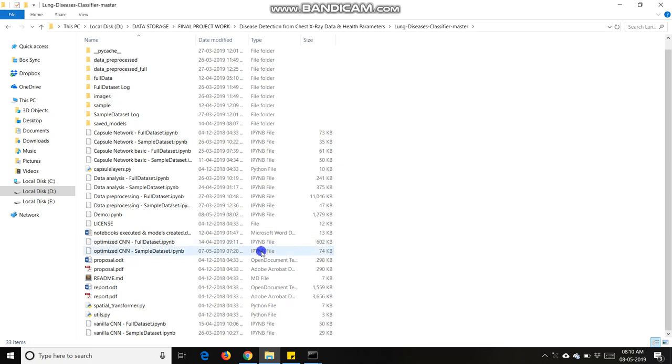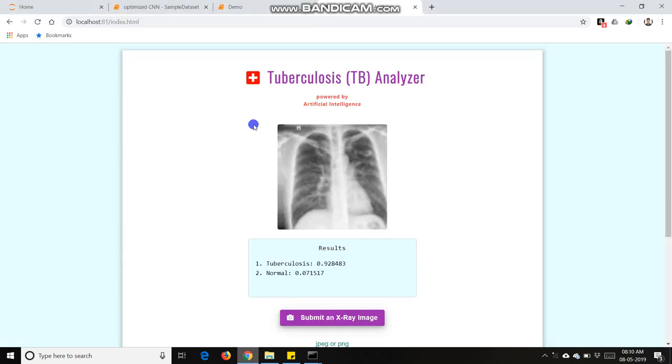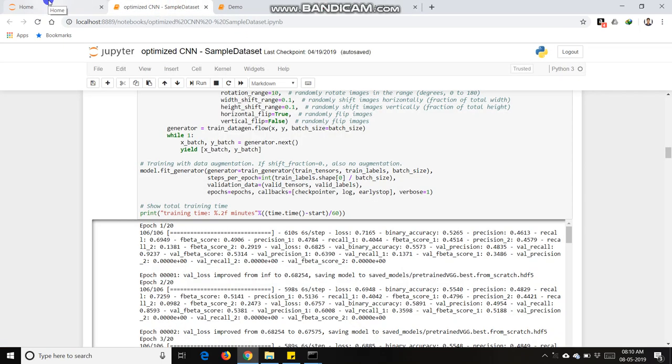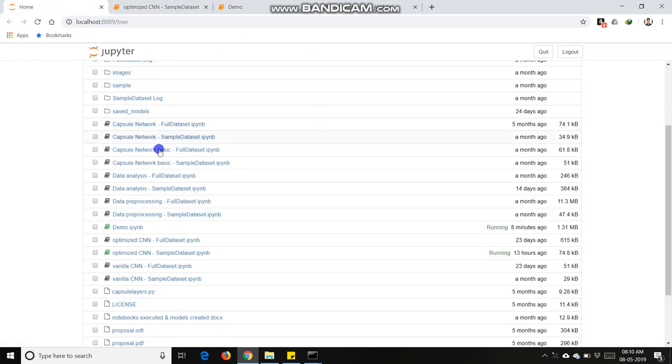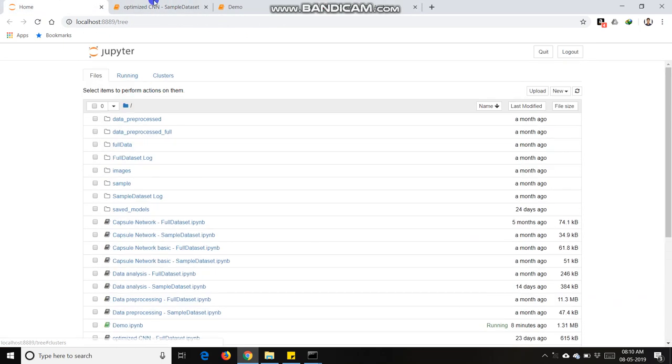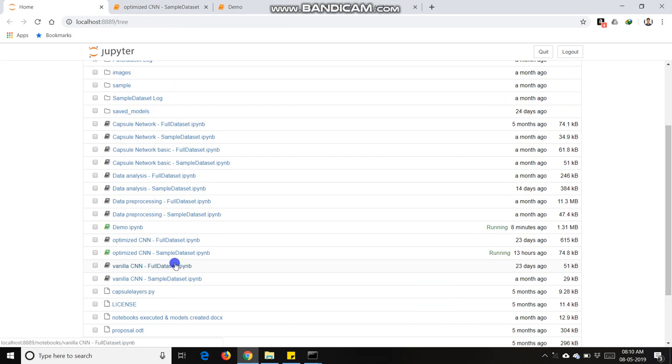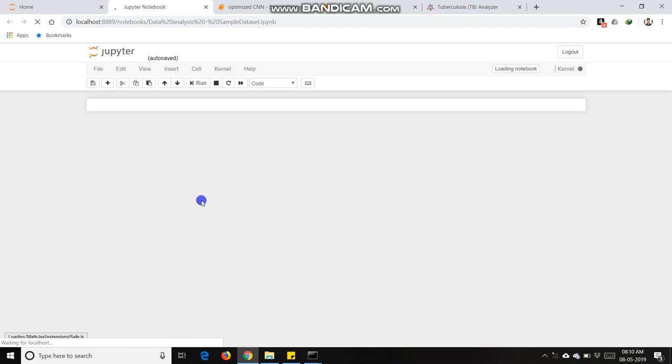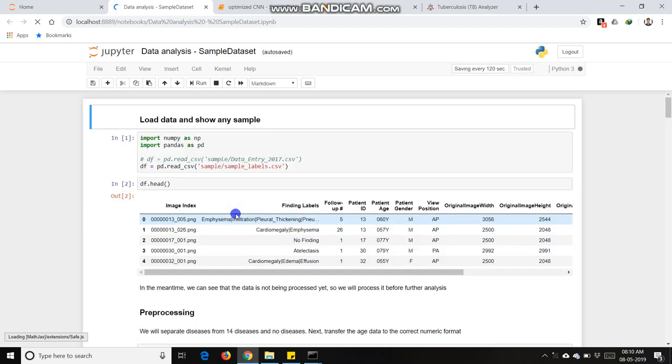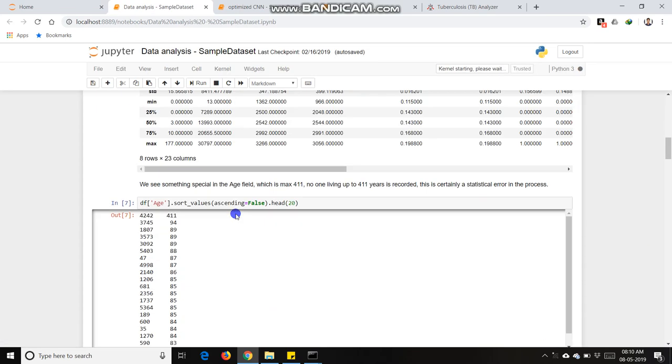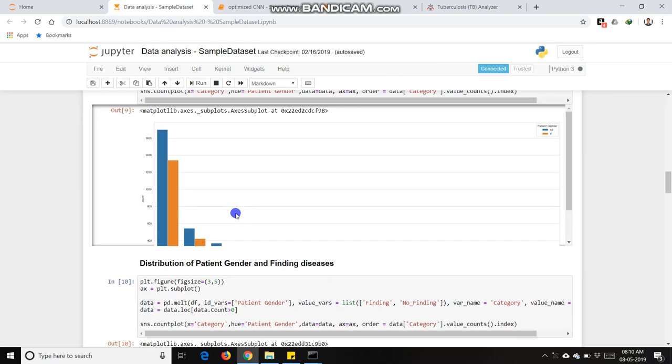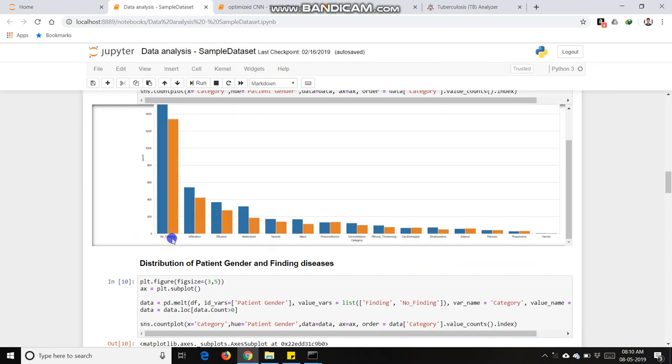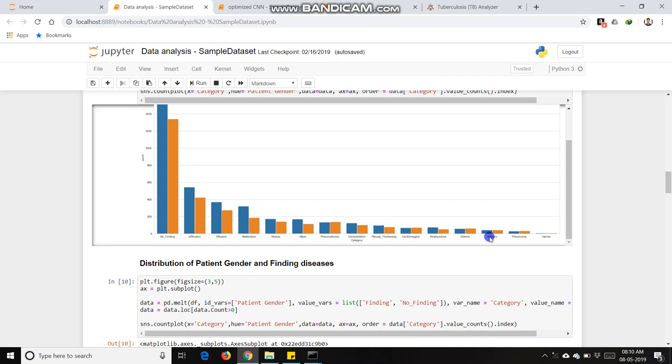I am showing you files in Jupiter notebook. I also done analysis of these diseases in which we can see which disease has more probability to happen: infiltration, effusion, nodular, mass, all the 14 diseases.